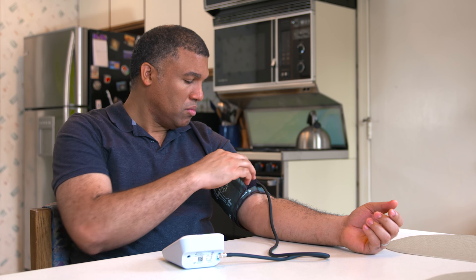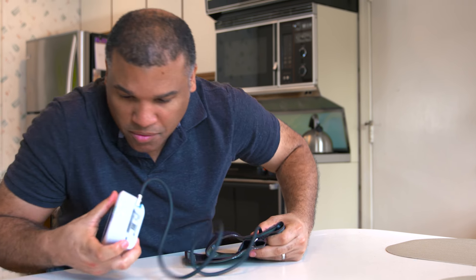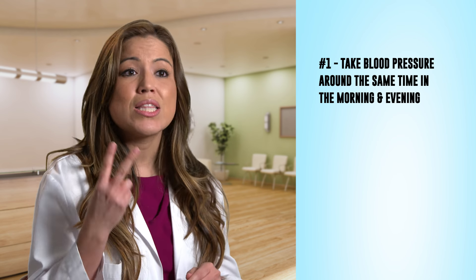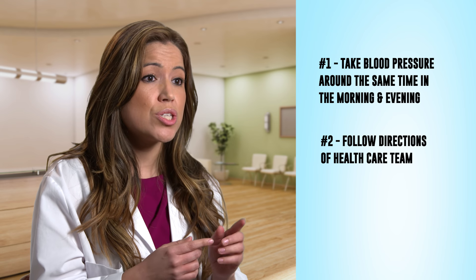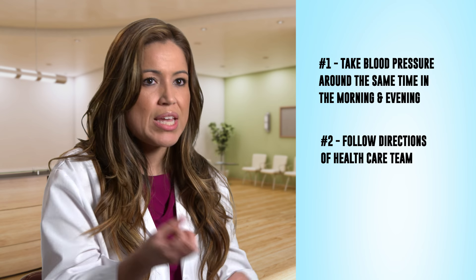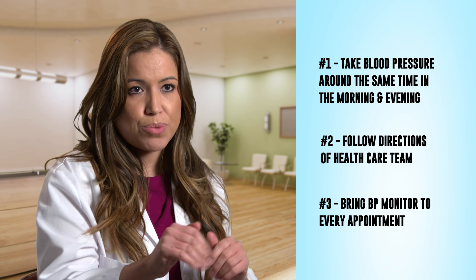When finished, remove the cuff from your arm and place the monitor in a safe and dry place. There are three things you should remember. Number one, take your blood pressure in the morning and evening at the same time. Number two, follow the directions of your healthcare team on how to bring the readings to your provider. Number three, don't forget to bring the actual monitor to all your appointments.